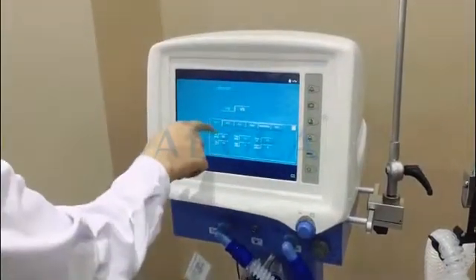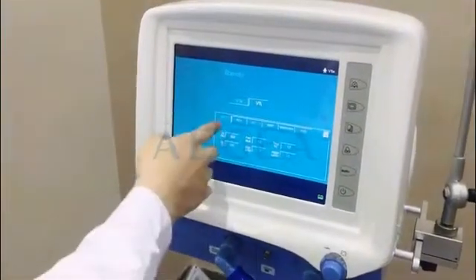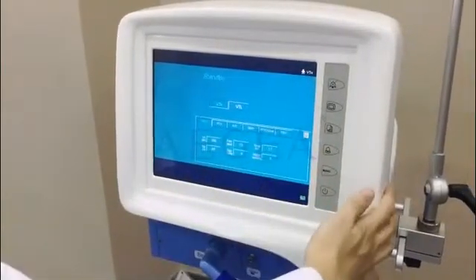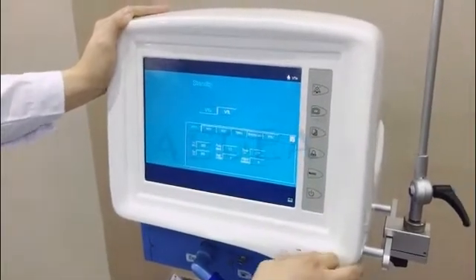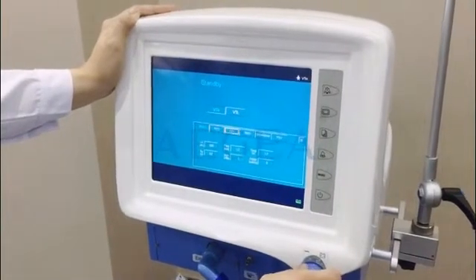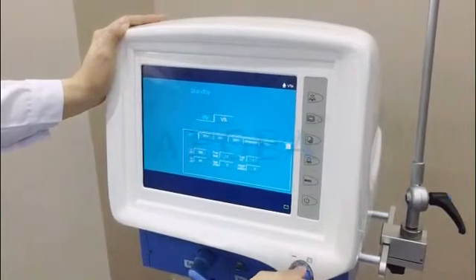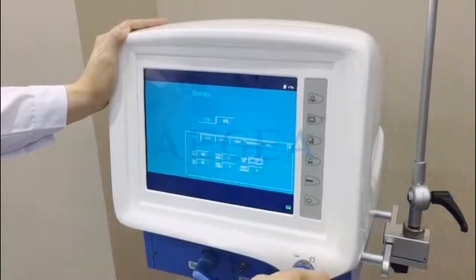Now you can see we have several modes of ventilation: IPPV, PCV, AC, and so on. It actually has eight kinds of modes for different patients. We can turn the knob to change the settings — the tidal volume, frequency, peak — and change them by ourselves.